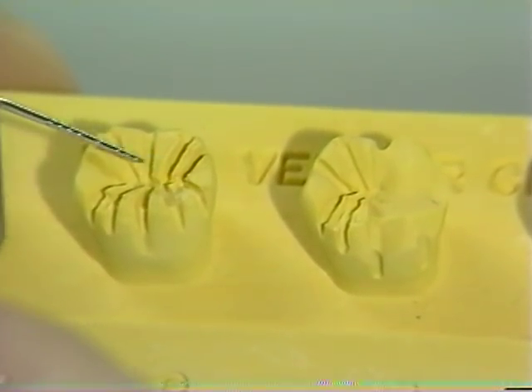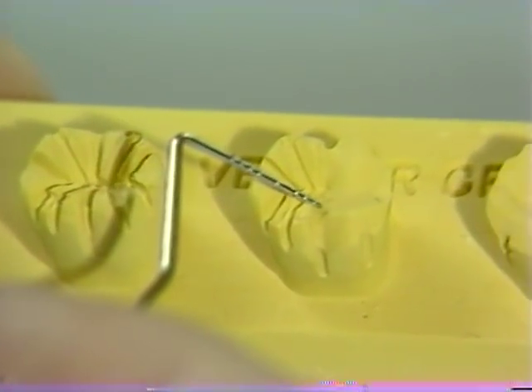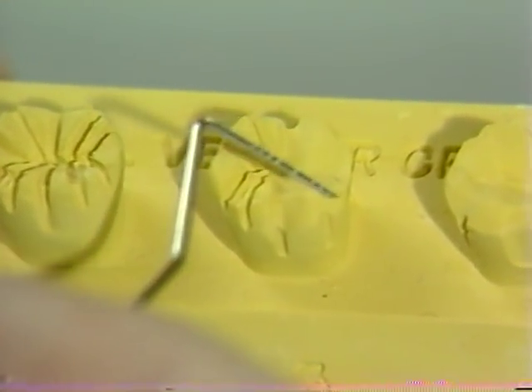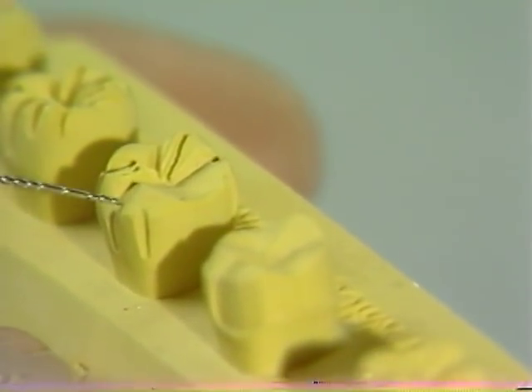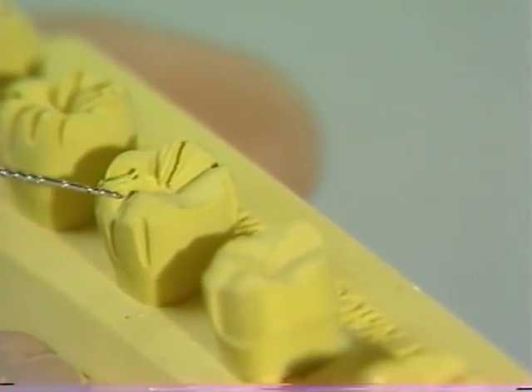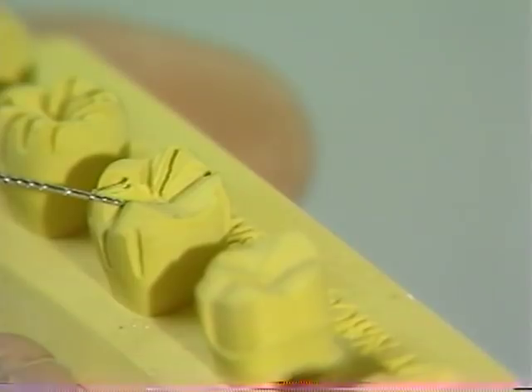After these initial guiding grooves have been placed, we can proceed with half of the occlusal reduction, retaining the distal half as a reference. Note that a functional cusp bevel extends over the functional cusp, which again results in an approximate reduction of 1.5 millimeters.